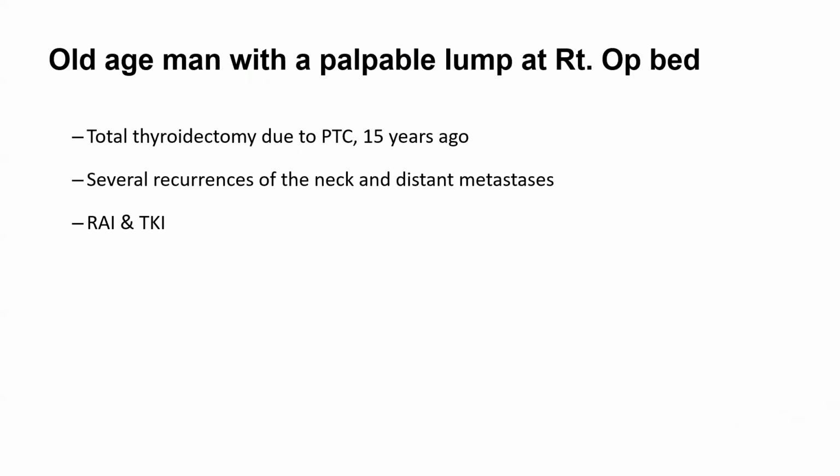I'll show you a case. He had undergone total thyroidectomy 15 years ago for thyroid papillary cancer at an outside hospital. Since then, he has had several recurrences of the neck and distant metastasis, and has been treated with radioiodine treatment and targeted chemotherapy. He did not do chemotherapy anymore because of the side effects of chemotherapy.